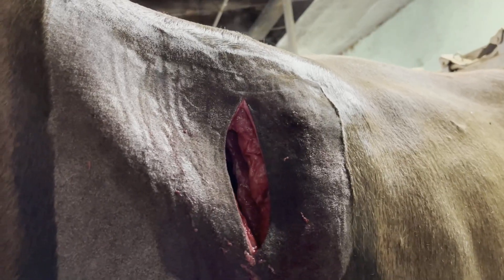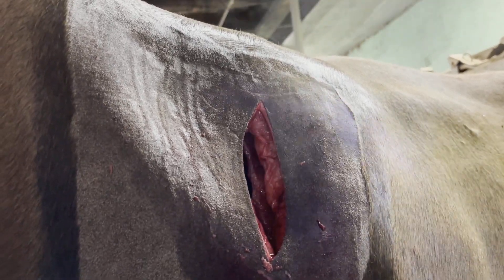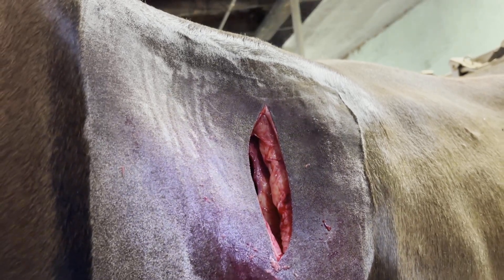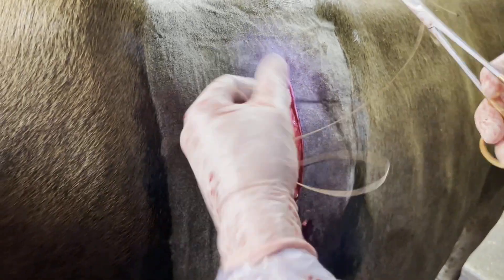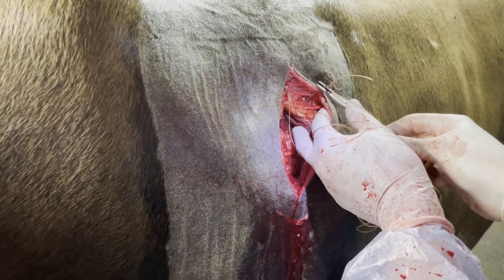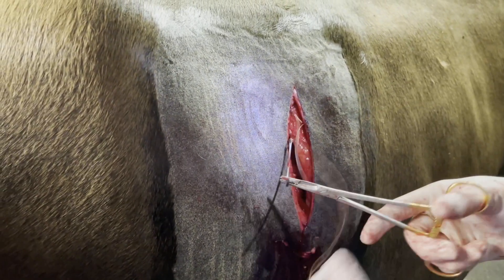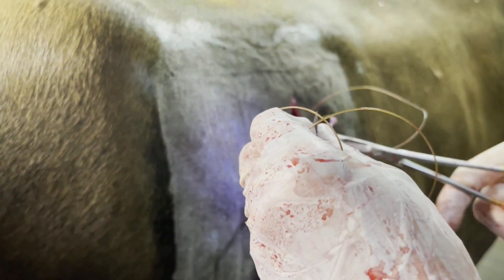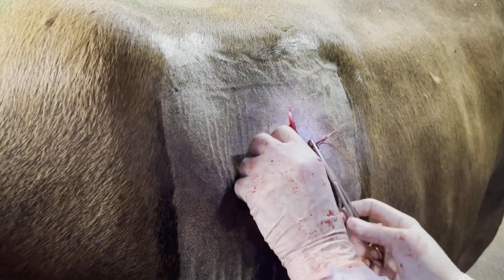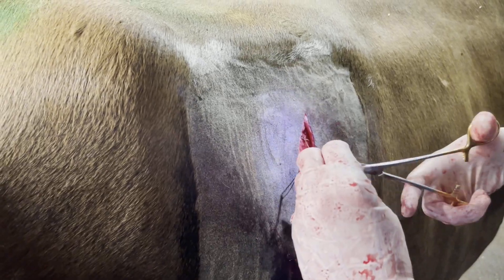Every time she breathes you can see steam shooting out, which is from the inside of the abdomen. Now I'm doing my second layer of closure — I include the muscle and the subcutaneous tissue, get it all lined up so it's going to heal well, and then we'll do the skin at the end. Cows heal fantastically from this.